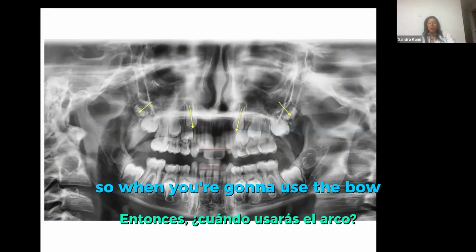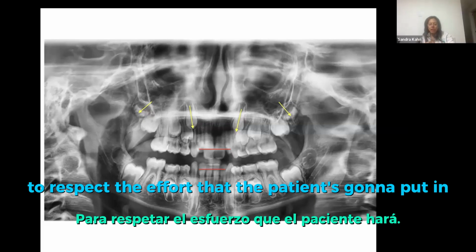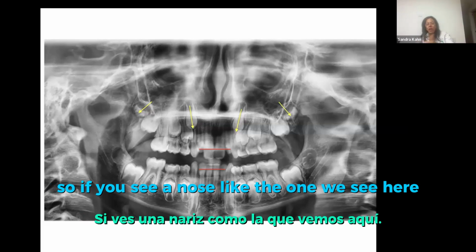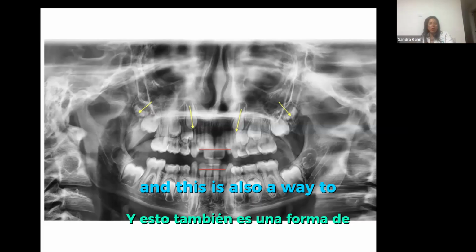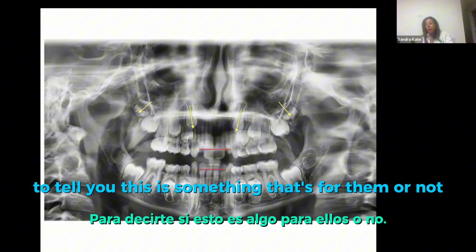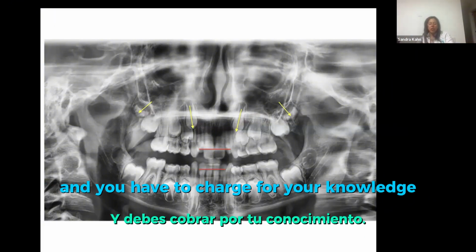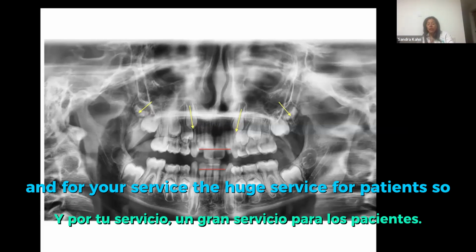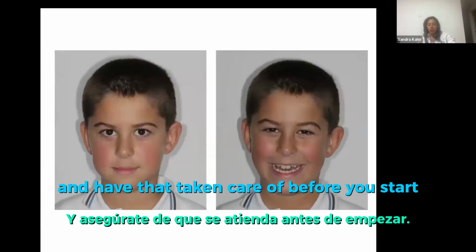So when you're going to use the bow, you want to maximize what you do as a clinician to respect the effort that the patient is going to put in. So if you see a nose like the one we see here, you've got to take care of that. And this is also a way to guide your patient to tell you this is something that's for them or not. This is not an expensive treatment. There's a lot of responsibility and you have to charge for your knowledge and for your service. It's a huge service for patients. So you send them to the ENT and have that taken care of before you start.